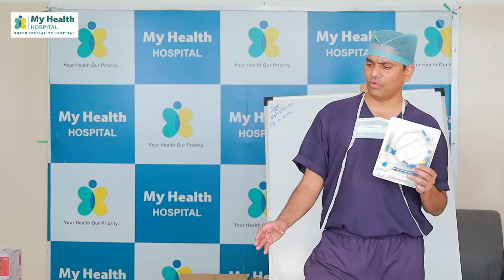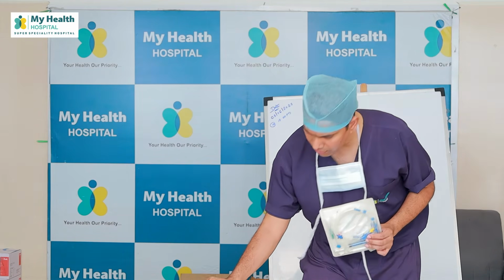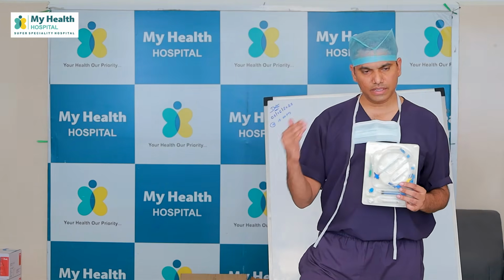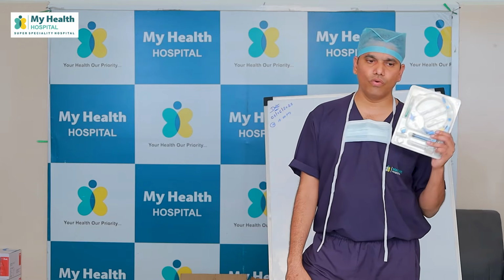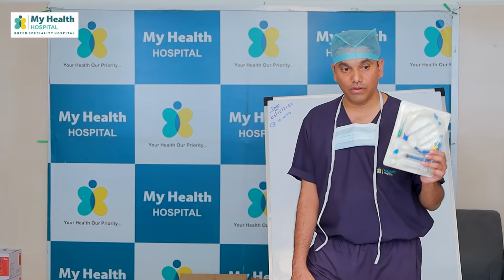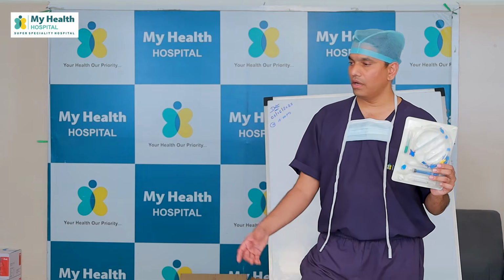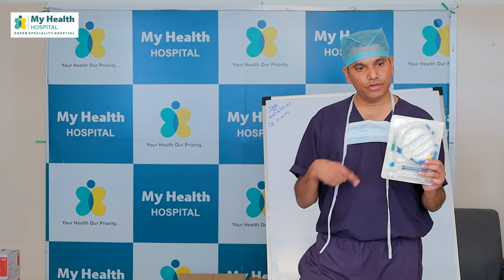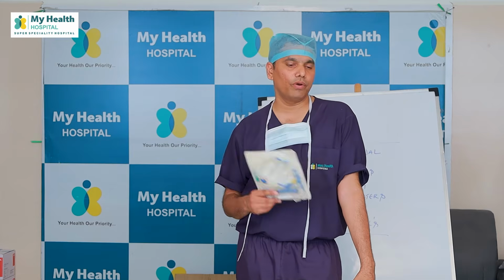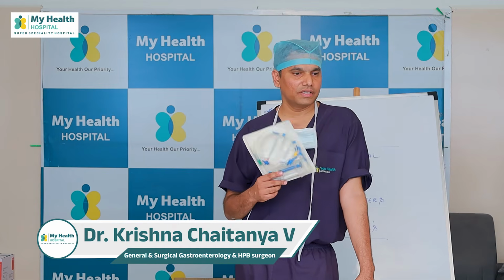See, a patient who is coming with an IV cannula, from IV cannula we are going to central line. That itself says the seriousness of the patient. So a patient who requires more rigorous volume monitoring, infusions, inotrope support, with a continuous flow rate, we use this double lumen. But what is the need for a triple lumen? What is the additional lumen that helps us? To measure CVP, central venous pressure. The other lumen is for measuring CVP.